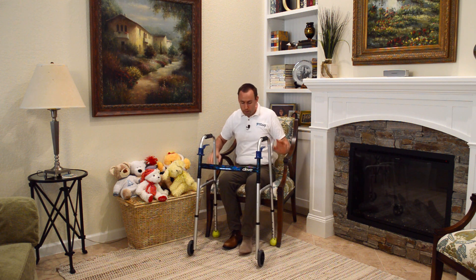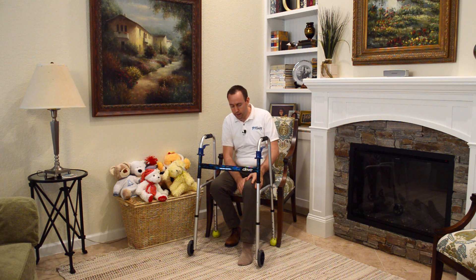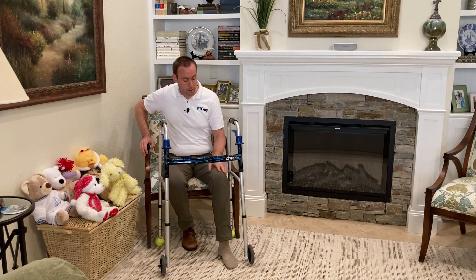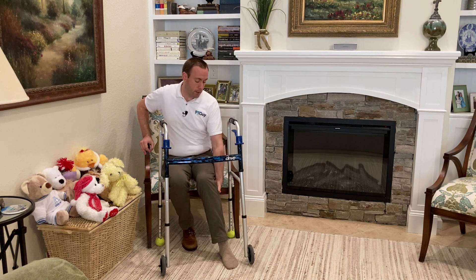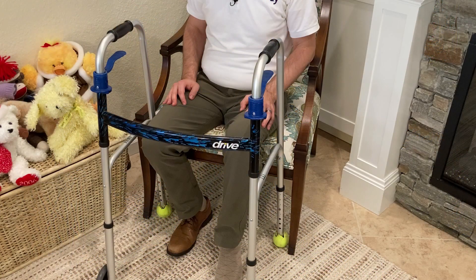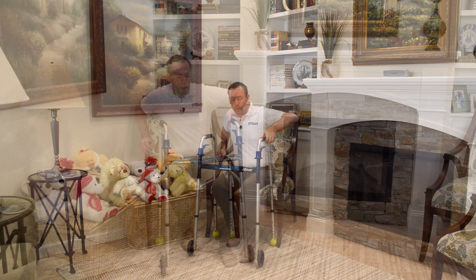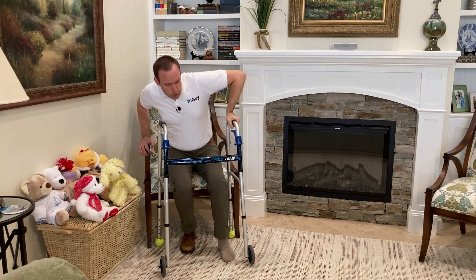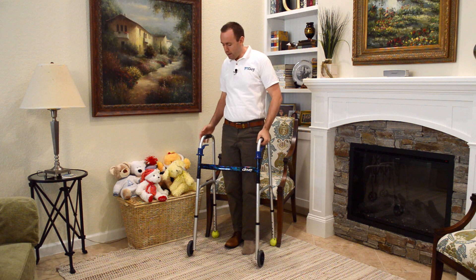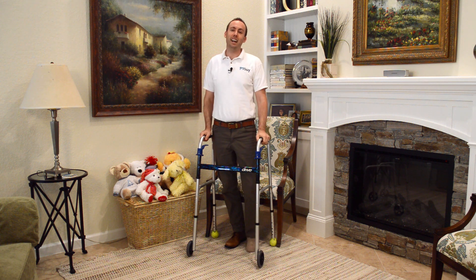Let me show you the full technique one more time. Scoot up to the front of the chair and get your feet back. Pretending I'm not allowed to put weight on my left leg, I put my right hand on the chair on my strong side, and my left hand goes up on the walker first — before I even get up. Then I rock back and forth, nose over my toes, and one, two — push up. I go from a staggered step, like a stepping stone, and once I'm up I've got it. I always maintain one point of contact. That's the stagger step technique.